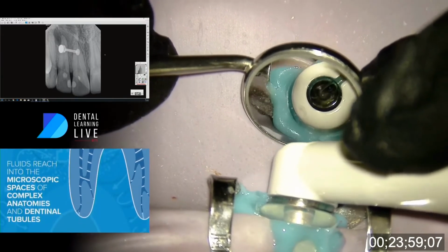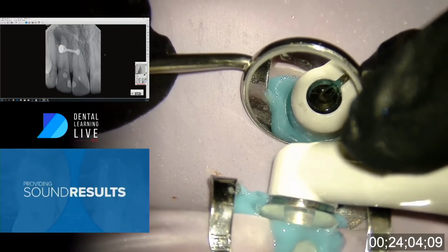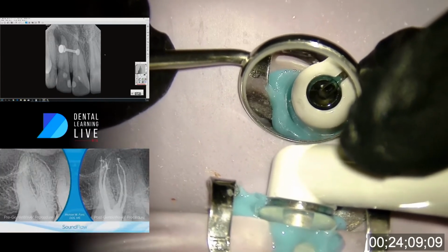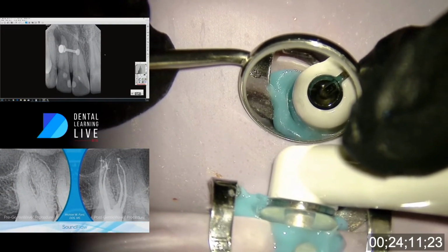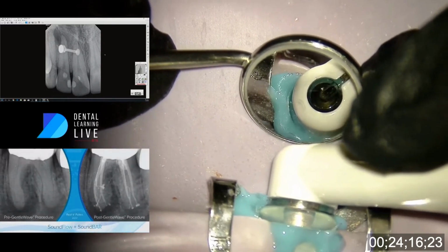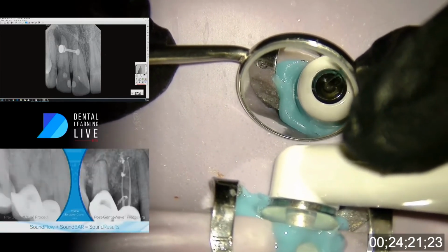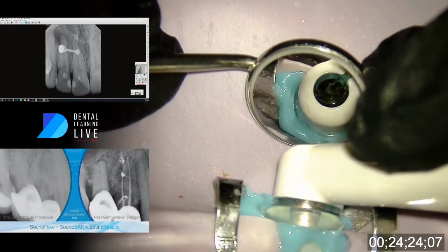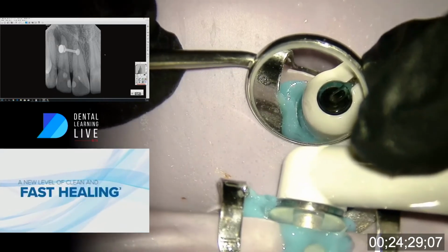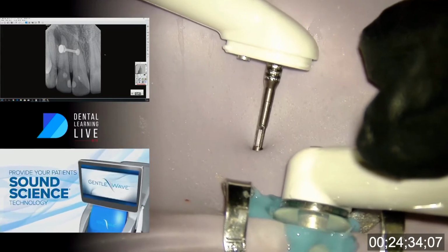Now, the way that the mechanism works is unique to this anterior premolar handpiece, and that's why they call it the APM. And it's used just for anterior and premolar. The molar looks a little bit different. Lindsay, if you want to grab a molar handpiece and put it in the field of view, they can see that. But the results kind of speak for themselves. When you look at the screen to the left, these images that are popping up are done by other practitioners. They are very consistent with what the GentleWave looks like. So the molar, there we go. It looks like that. And that's the sound bar that's coming down through there.